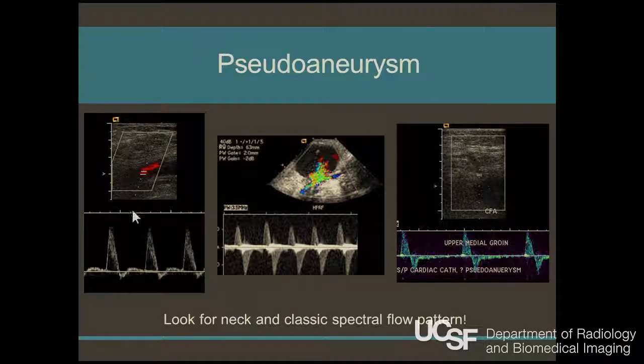That's real life. So what I want to point out is that, here's a normal femoral arterial waveform. Here's a nice pseudoaneurysm. That's not going to be a problem. But in this case, you don't see a whole lot of flow. Actually, there's a color box on. So there is color on. You're not really seeing anything. But there were flashes here and there.